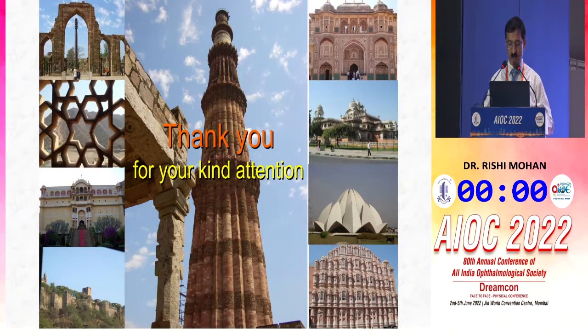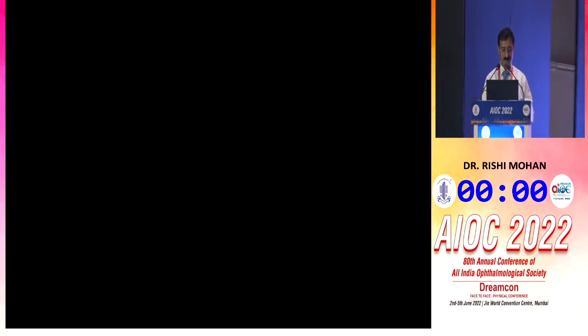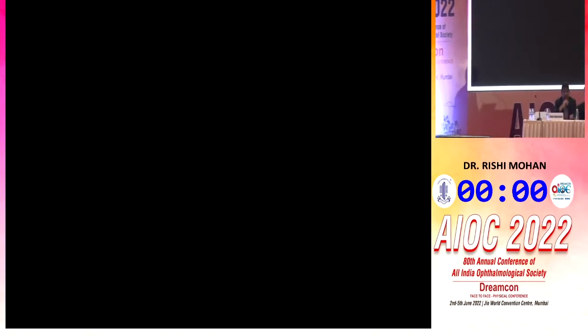I'll be very happy to take any questions. Thanks, Amit. Thank you so much, Dr. Rishi. Dr. Rishi Mohan has very nicely brought forth the role of corneal biomechanics. A lot of us are reluctant to do it. I have one question for Dr. Rishi: we do it in so many patients before refractive surgery, and do you repeat it after refractive surgery in these patients? And if so, after how long in patients who have had thin corneas, who have undergone LASIK, just to record something, that okay, fine, this is how it was.